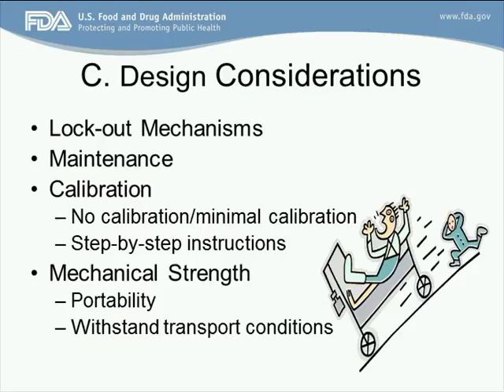Maintenance. Many people now, lay users, do have to start maintaining their own devices. If they're using them once a day, for example, that device is going to be there with them at all times. So they need to understand how to keep it clean, how to keep it dry, or whatever else they need to do, how to clean the components or the accessories. And a lot of times, too, with reimbursement issues, people tend to own their device after a few months of use. They only get reimbursed up to a certain period of time, and then they become owners of that device. So they are going to need to know how to maintain it.